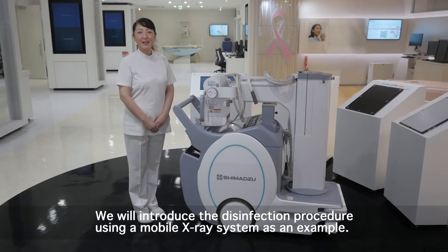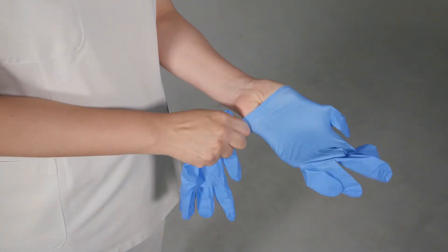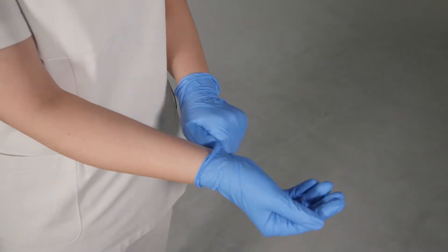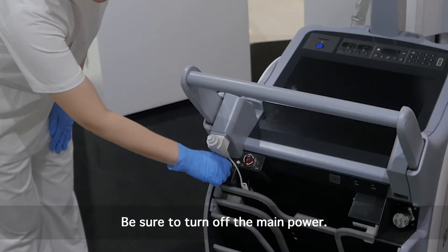In this video, we will introduce the cleaning and disinfection procedure for Shimazu Medical Imaging Products. Please change gloves and the cloth each time and use clean ones. Be sure to turn the system power off before cleaning and disinfecting the system.